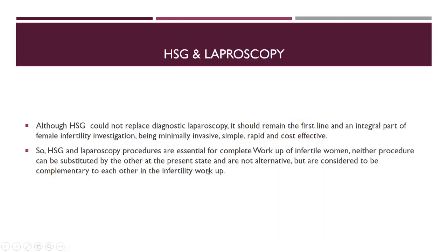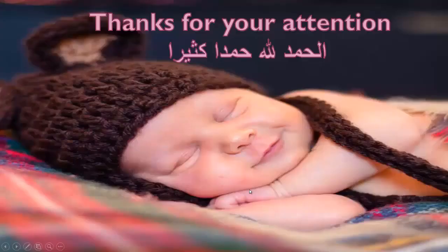So hysterosalpingography and laparoscopy are complementary to each other and not competitive. Hysterosalpingography could not replace diagnostic laparoscopy, but it is the first line and an integral part of the female infertility investigation. It is usually minimally invasive, rapid, and cost-effective. So they are completing each other, and the gold standard is the laparoscopy, of course.